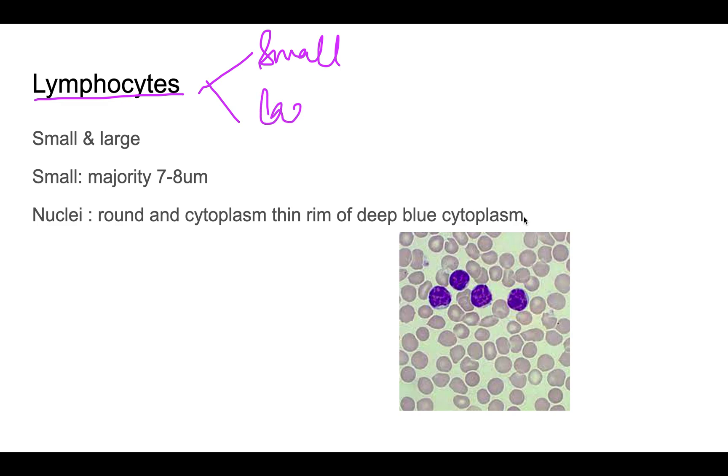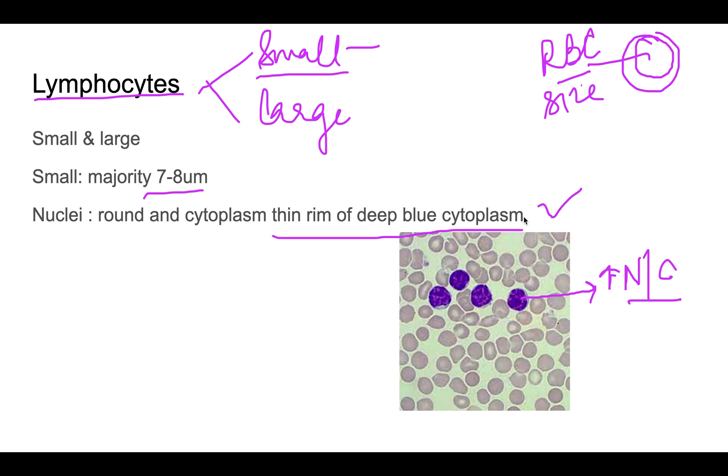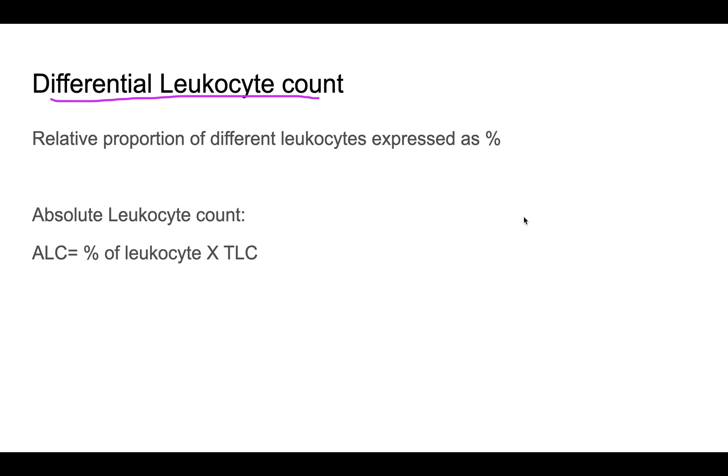Lymphocytes are divided into small lymphocytes and large lymphocytes. The majority are small lymphocytes — the smallest of all leukocytes at around 7 to 8 microns. In small lymphocytes, the nucleus covers almost the whole cell with a high N:C ratio and just a thin rim of deep blue cytoplasm. Large lymphocytes have slightly more abundant cytoplasm.